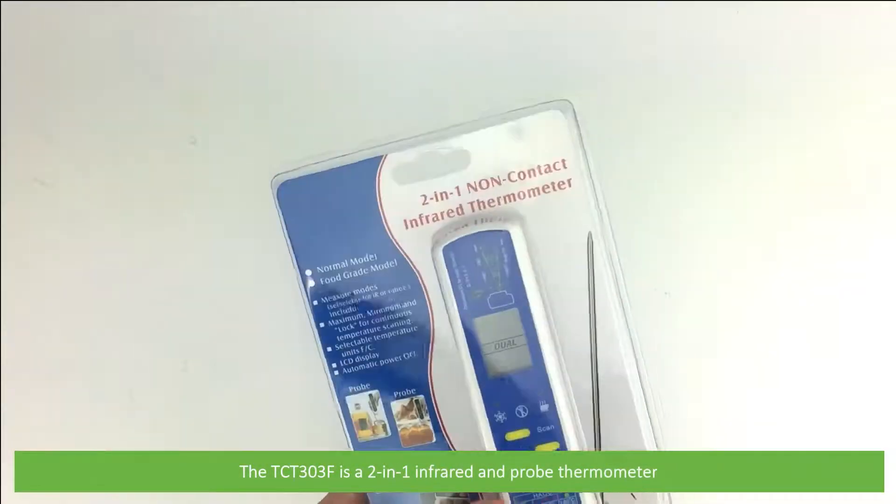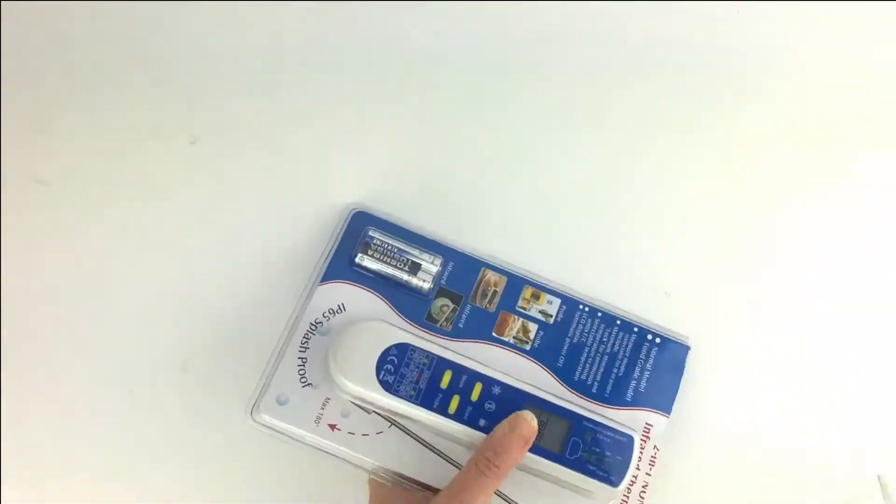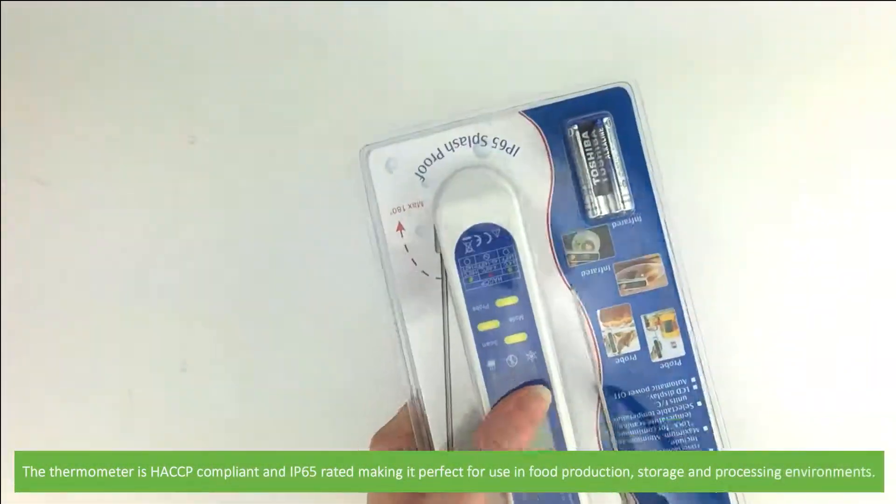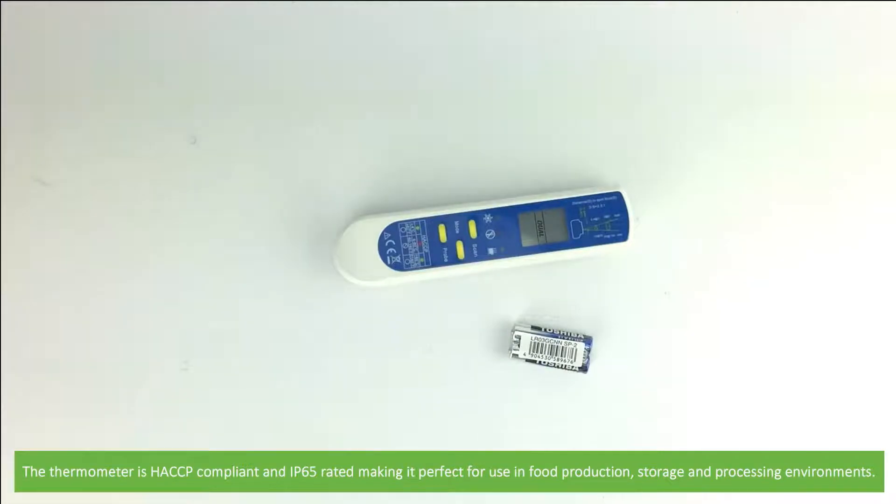The TCT303F is a two-in-one infrared and probe thermometer. The thermometer is HACCP compliant and IP65 rated, making it perfect for use in food production, storage, and processing environments.